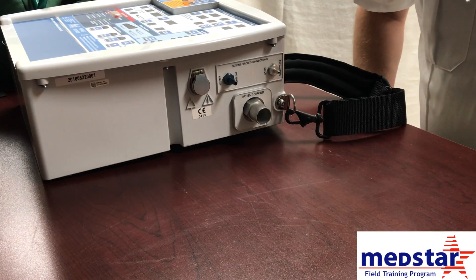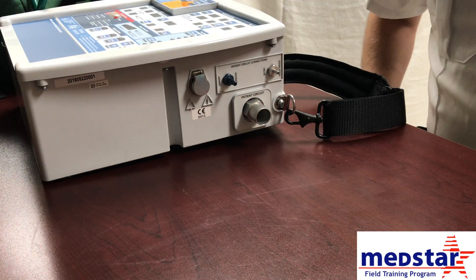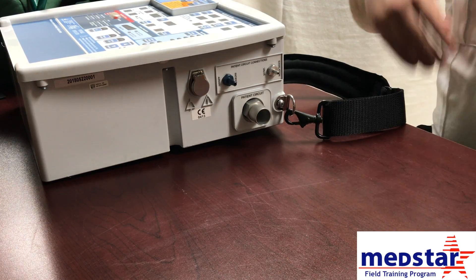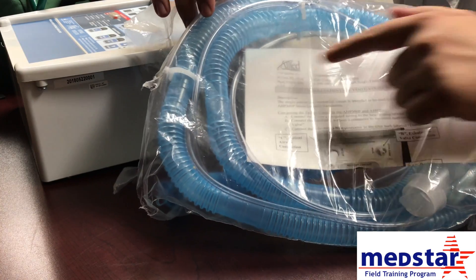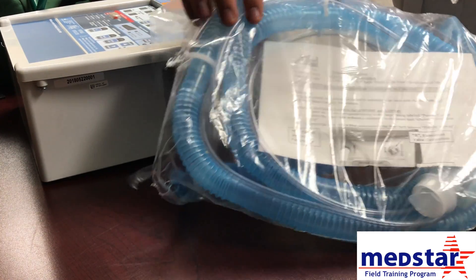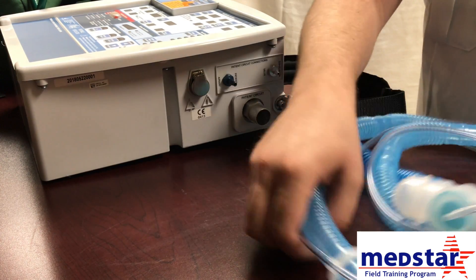In this video we're going to talk about how to set up the AHP 300 ventilator. The first thing we're going to do is look at the tubing. The tubing comes packaged like this — it is by Allied Healthcare and it is blue tubing. We're going to take that tubing out of the bag and show you how to hook it up to the ventilator.